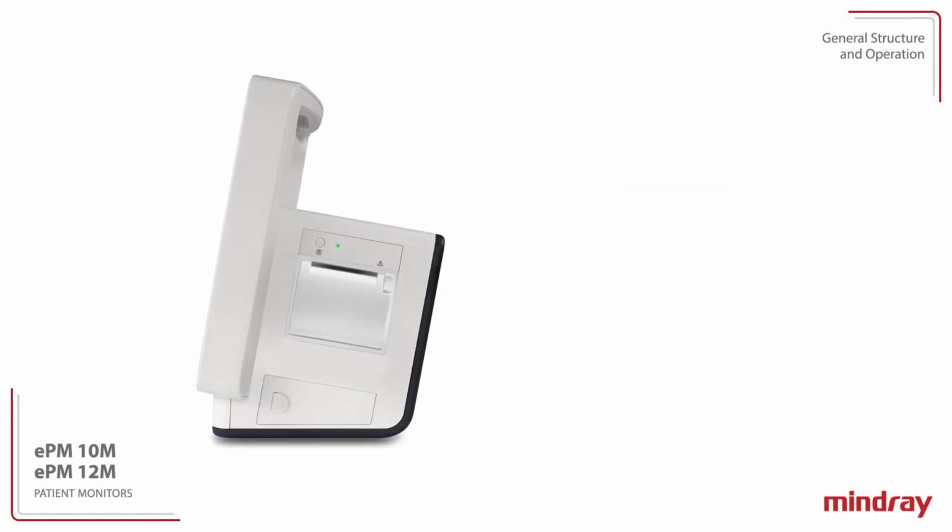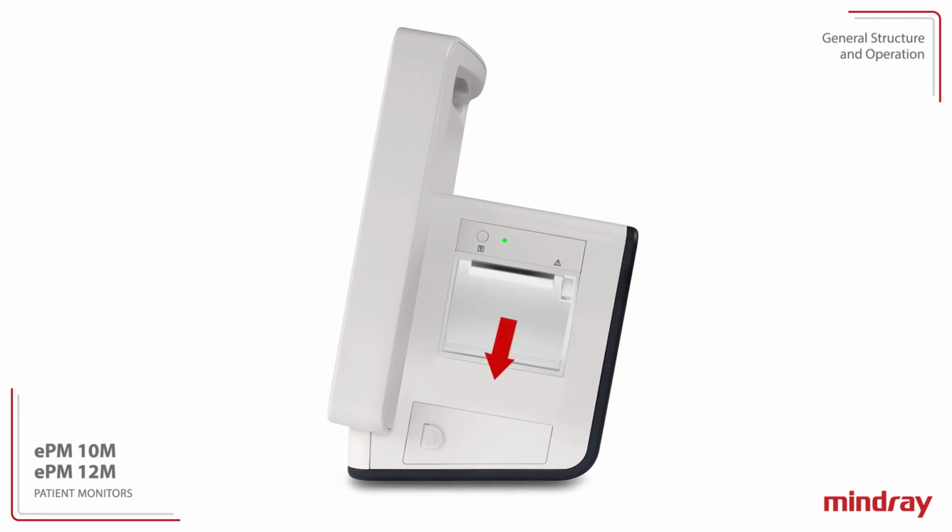The right side of the ePM 10M and 12M patient monitors contains the integrated thermal recorder and the battery door. Load the recording paper by pulling back the latch to open the recorder door, inserting the paper roll with the thermal side up, and closing the door. Press the button above the record symbol to initiate a recording. Press the button to stop an active recording.